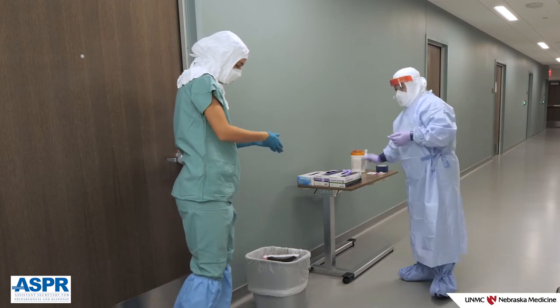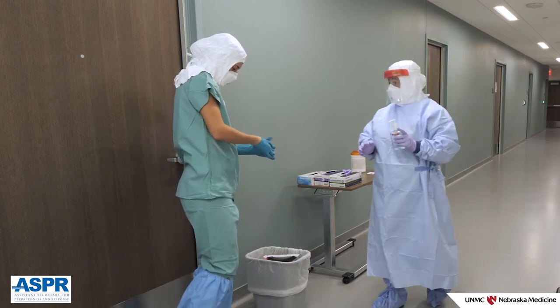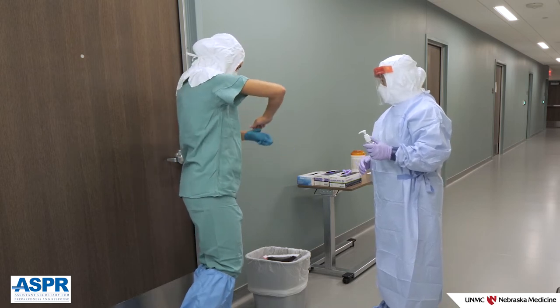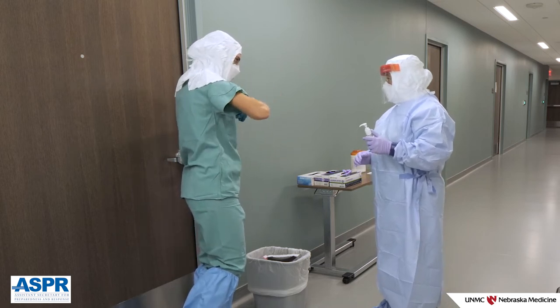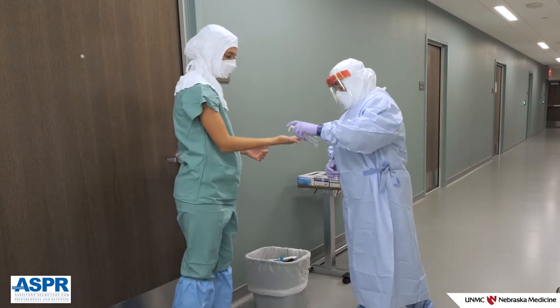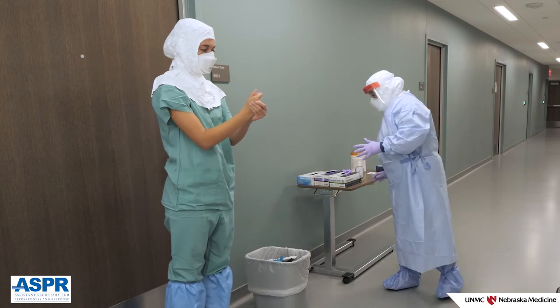Remove your last pair of gloves, perform hand hygiene, and don clean gloves. It is very important to perform hand hygiene and don clean gloves before doffing the hood to mitigate the risk of exposure, as hands will be in close proximity to the mucous membranes during doffing of the hood.